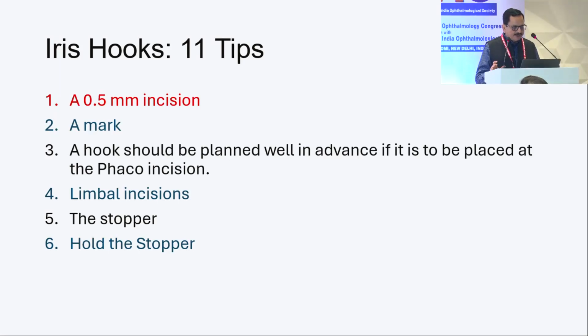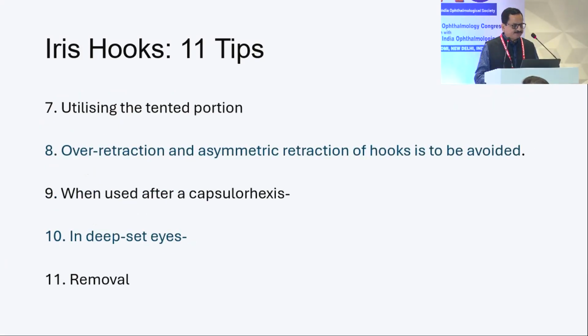There is a stopper end. Hold the stopper and you can rotate the iris hook to the desired position. And utilizing the tented portion, we just stretch it and slightly it comes out. Then over retraction and asymmetric retraction of the hooks are to be avoided.